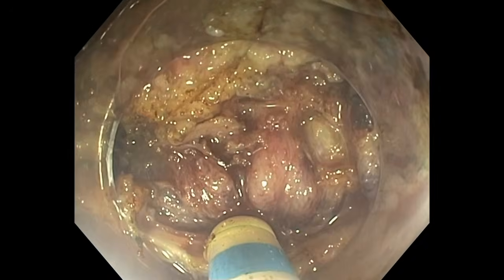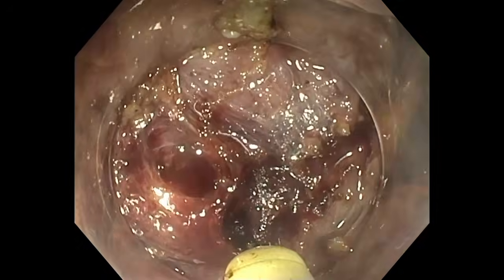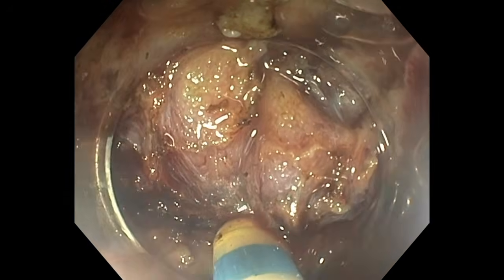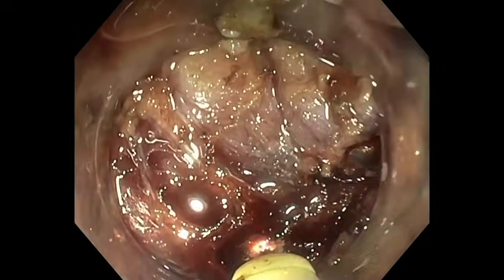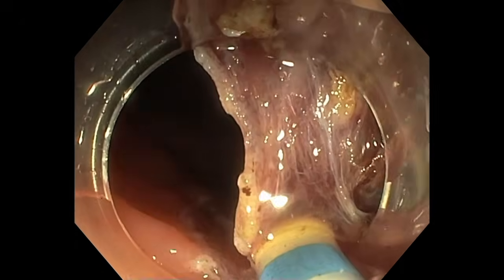Fortunately, we do this muscular damage at the end, so we will be able to close it quickly. That's also why I prefer to deal with the muscle retracting sign at the end and not at the early phase of the procedure.